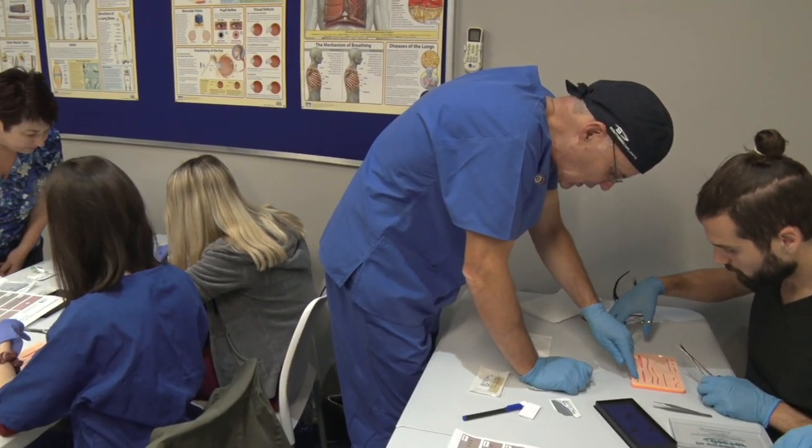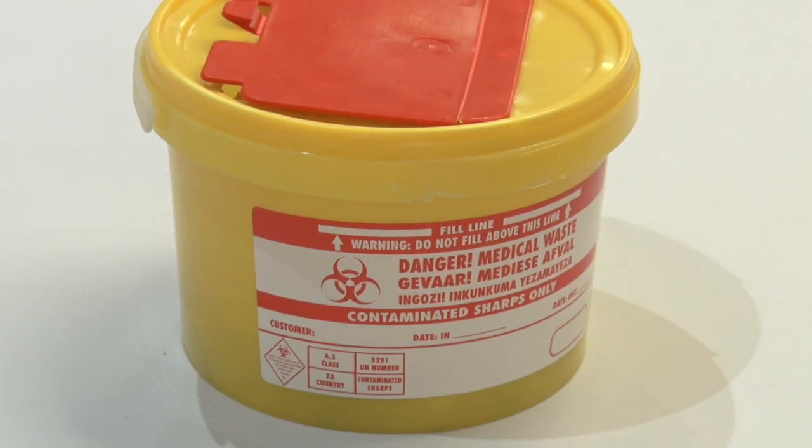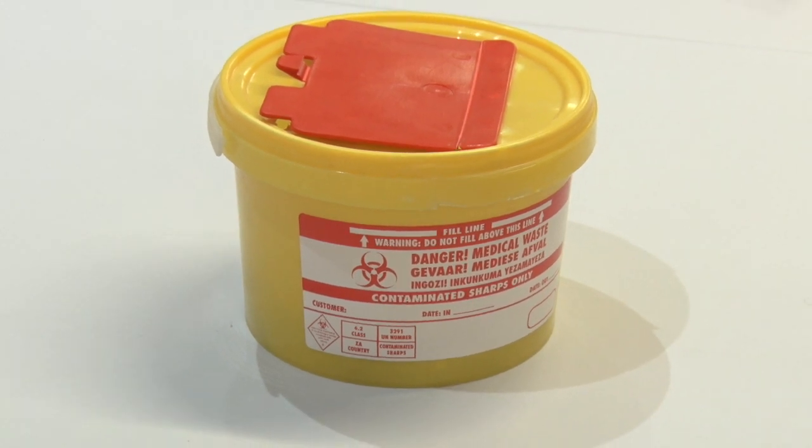Students practice suturing techniques while the instructors supervise, mentor, and assist. At the end of the workshop, the sharps are collected in appropriate sharps waste containers and the trash is discarded.